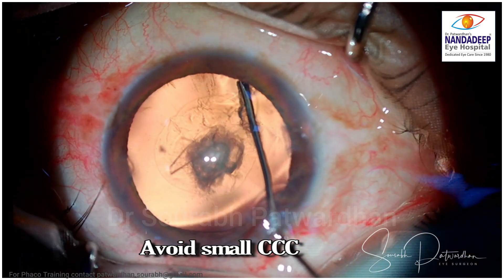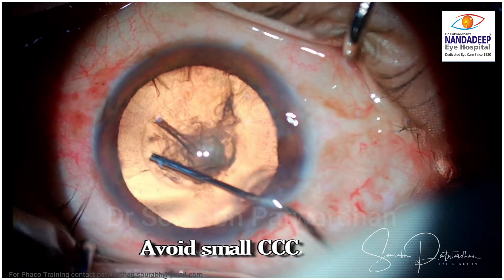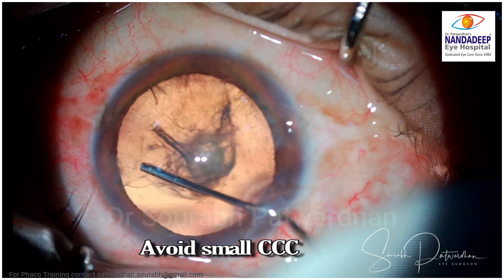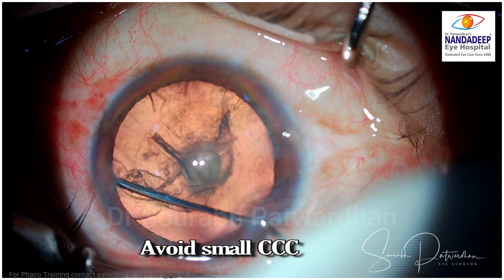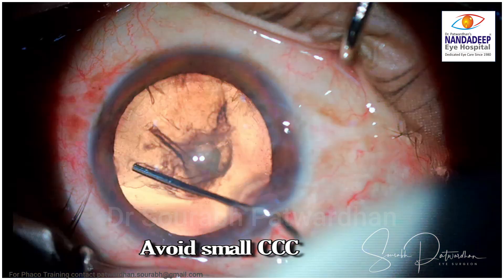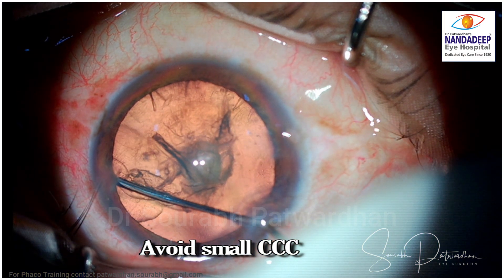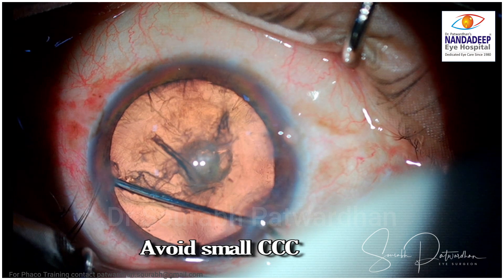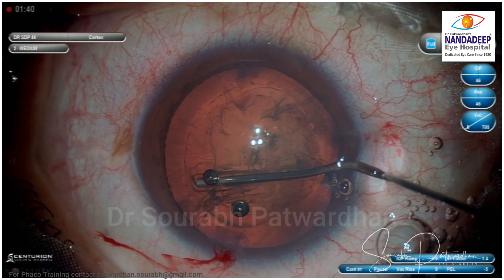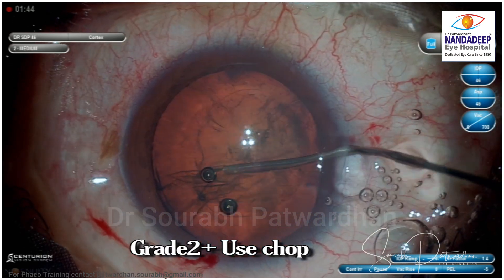Two things we absolutely have to avoid: first, a small CCC. If you have a small CCC it is very difficult to do hydroprolapse, and you risk having a hydro rupture of the posterior capsule. So if you have a small CCC, better to enlarge it before planning this technique, or go ahead and do a divide-and-chop technique — whichever is your technique of choice in that case.